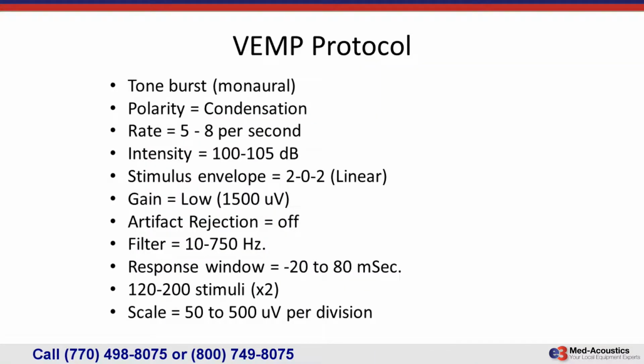This is the protocol that we use. The stimulus we use is a tone burst. Actually, a 500 hertz tone burst. The polarity that I use is condensation. Remember, I'm punching the saccule with it. And it is applied at a slow rep rate, somewhere between 5 and 8 stimuli per second.